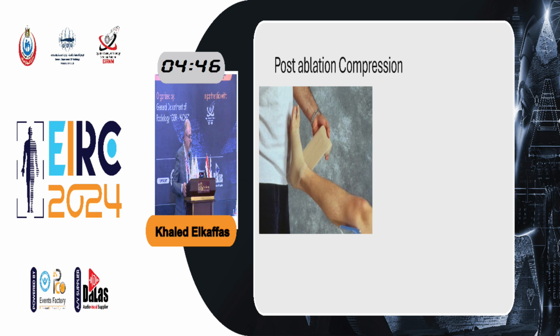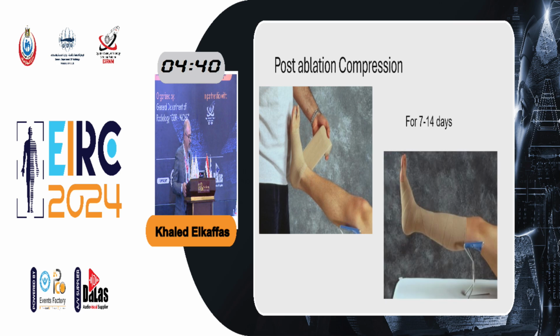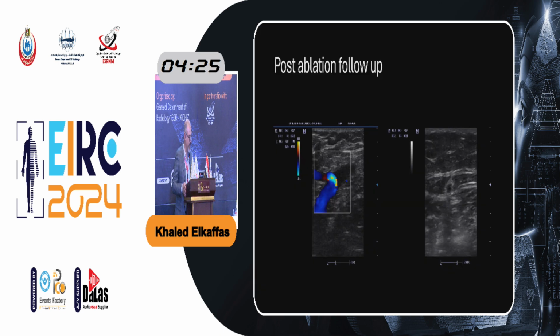After we finish the procedure, we wrap the patient's leg with a compression bandage or stocking for about 7 to 14 days. As we have told you, it's an outpatient procedure, no anesthesia, so the patient can take rest for 30 minutes to 1 hour, then go back home and start ambulation and moving. He can go back to his work the next day.